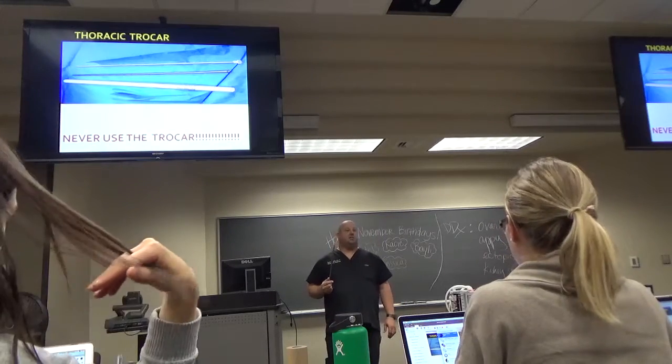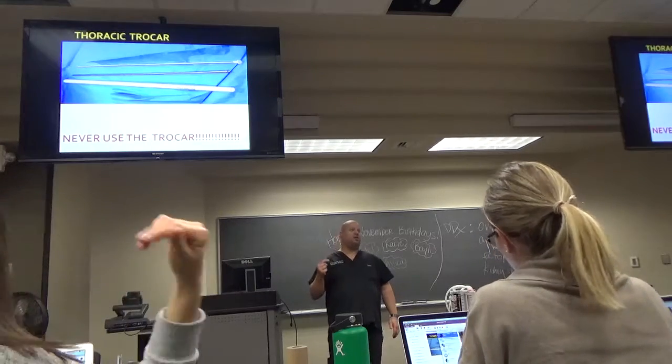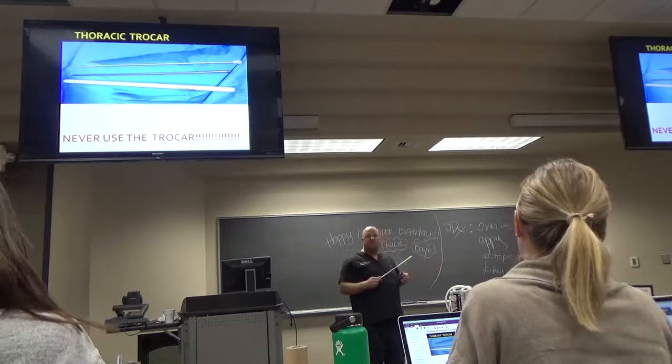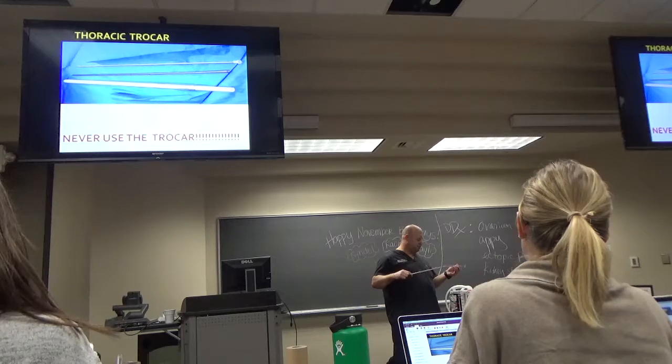Your attendings will be crapping their pants, and you'll be getting your ass chewed for about an hour if they walk in and see you with a trocar in your hand. Never use a trocar to place a chest tube. Some of these older school attendings will, but they make the big bucks and they call the shots. You should never use a trocar to put in a chest tube. Okay?